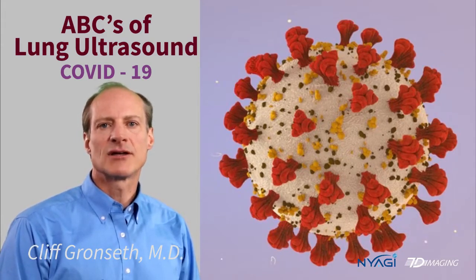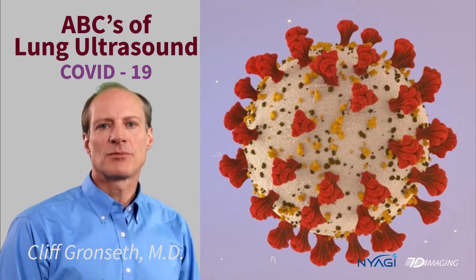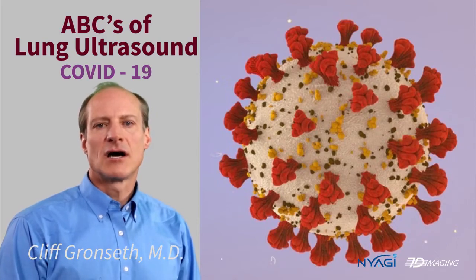Realize that the ultrasound is an extension of your physical examination. Like the stethoscope that allows you to listen to the lungs, ultrasound allows you to look inside the body real time.